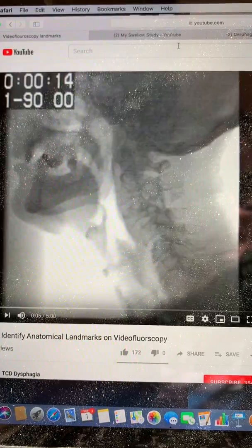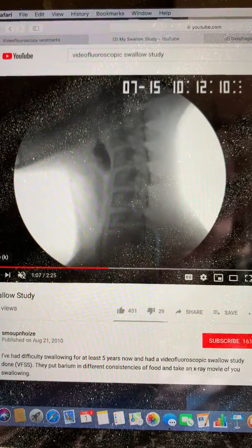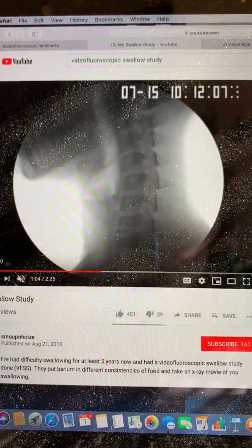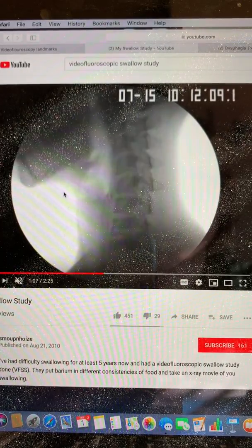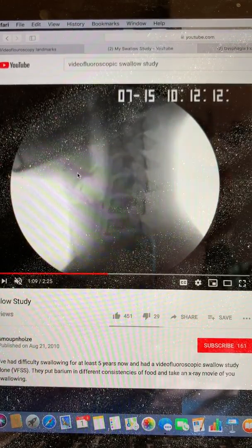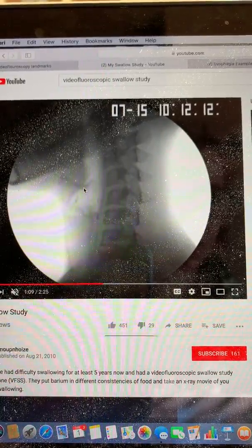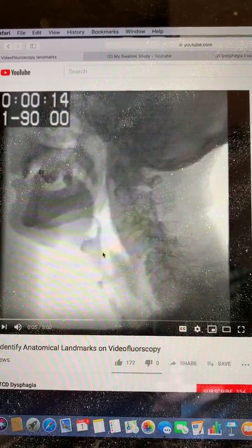And when that occurs, we'll go through this sequence. All right, so it's very fast. Let's see if we can watch that hyoid again. Okay, watch the hyoid. All right, so this hyoid is a little bit more difficult to see here, but it does go up and out. So when the epiglottis folds down, this protects it against penetration.